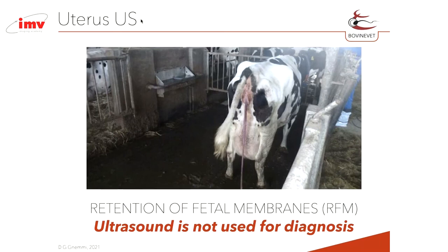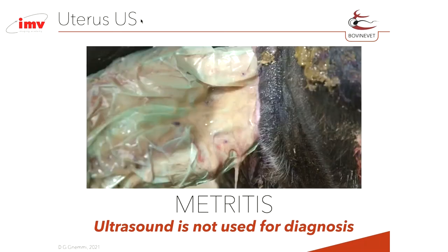Personally, I start to use my ultrasound unit only after day 10, 12, 13 after the calving, after the delivery. I'm not able to find an application of the ultrasound for the diagnosis of retained placenta, but also for the diagnosis of puerperal metritis. Well, I work with my ultrasound for the definition of clinical metritis, but not for puerperal metritis.